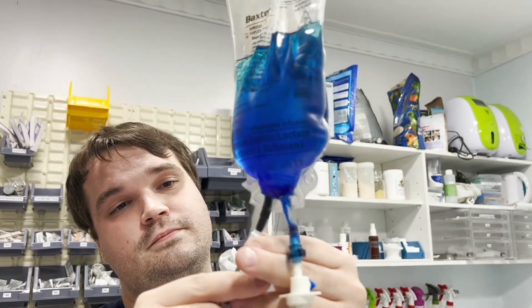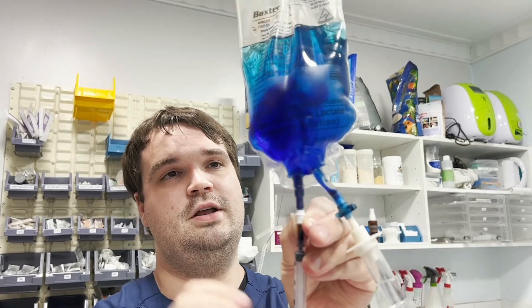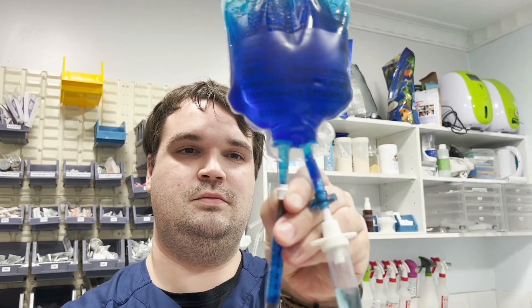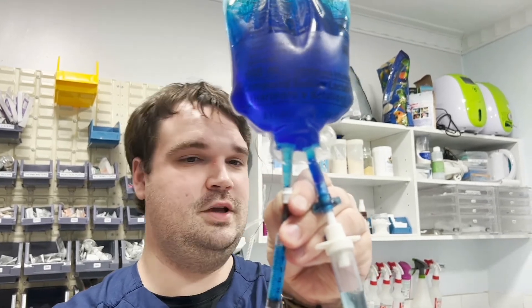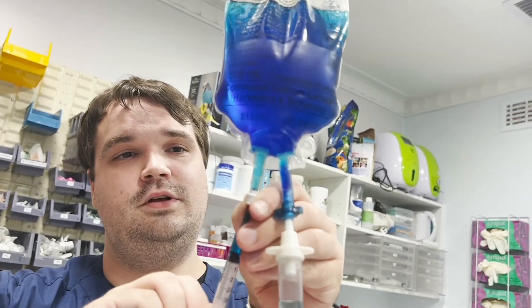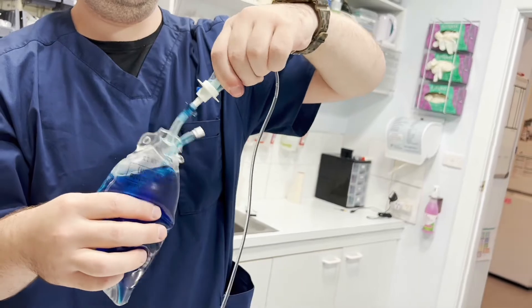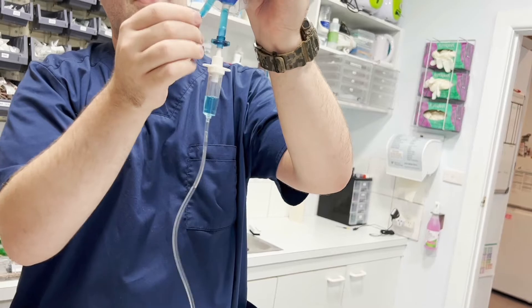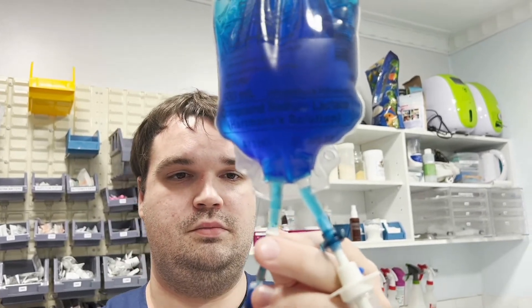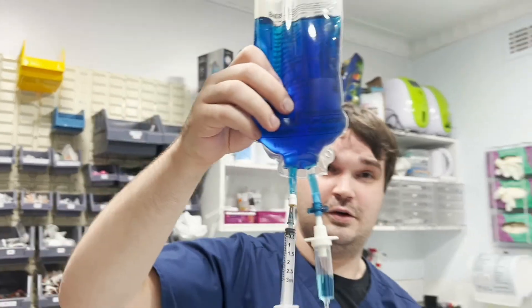We want to make sure to evenly distribute the medication by drawing back on it, sucking some back out, then squirting it back in to push it through. Do that a few times. Give it a good shake — you can see the colour changing already. Keep doing that a few times. Take it off the hook, squeeze it out, get everything through. And now all that medication that was originally sitting unevenly is evenly distributed throughout the whole bag, ready to go to the patient at the correct, even dose.